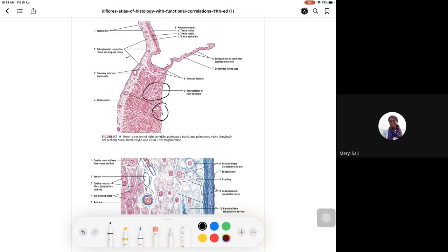If you get a biopsy like this with the major blood vessels and subepicardial adipose tissue, you have to call the clinician immediately and tell them, I see the full thickness of the cardiac wall, please check. The patient may be in a very critical situation. They may be knowing it, but it's better to tell them whenever you see.